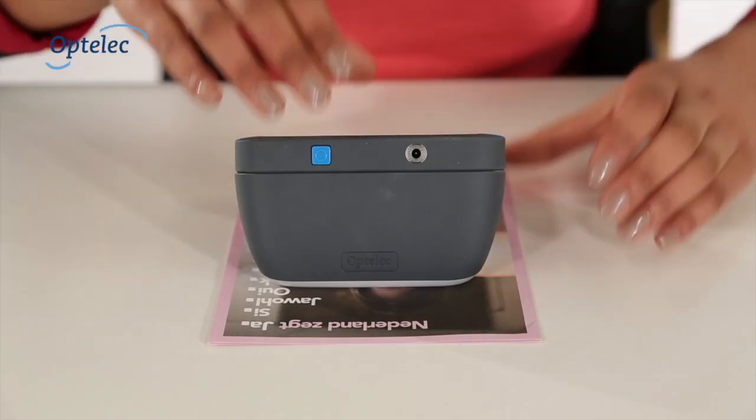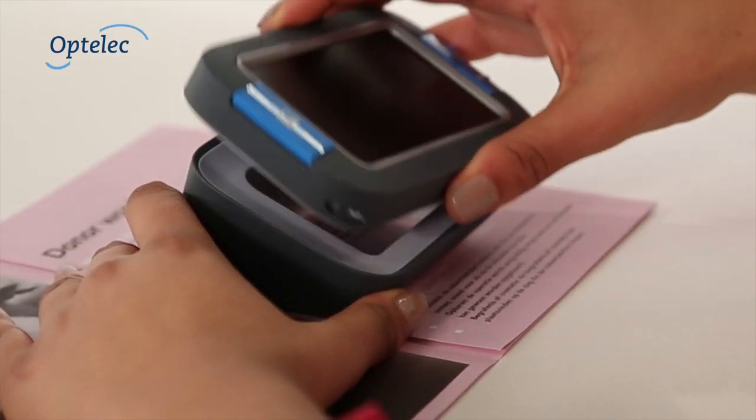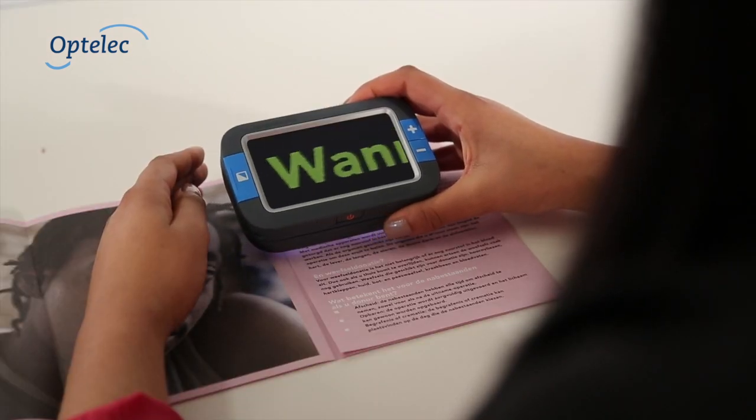The Compact 4HD is easy to use with an autofocus HD camera. The detachable magnetic stand will ensure that the Compact 4HD provides optimal reading pleasure.